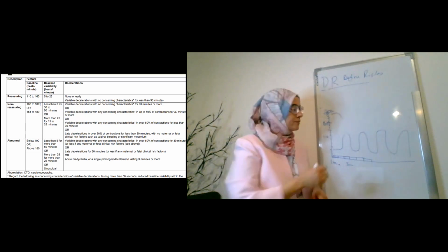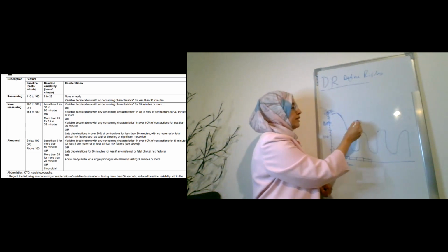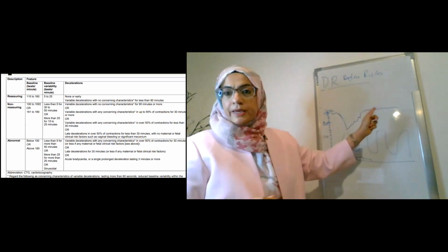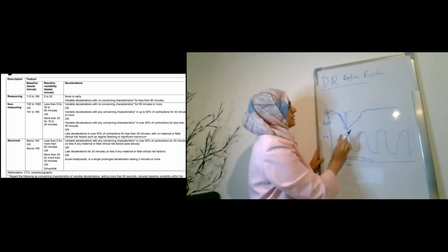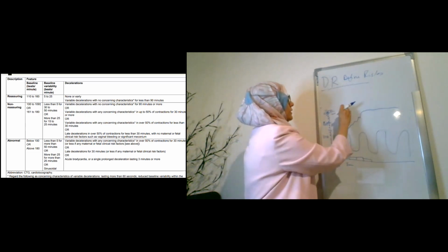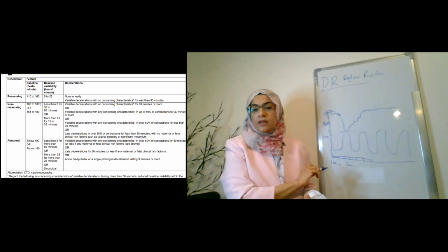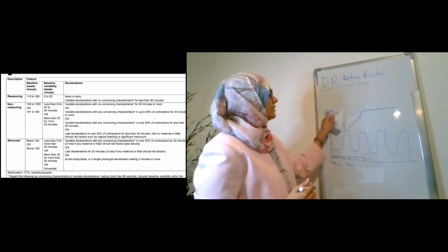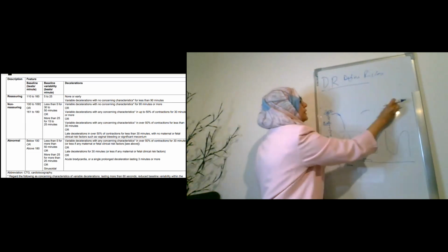So your swimmer baby goes down and it says, oh my God, I need to pick myself up. Okay. So then it comes back to its baseline again. So it takes time. So remember that quick rushing back up to the baseline, that's not happening. What is happening is that it's going to take some time. This is your timeline to come back to the normal. I call it the right tick sign, just to make it easier. So if you get this kind of right tick sign, that's when you would be worried and call that a concerning characteristic.